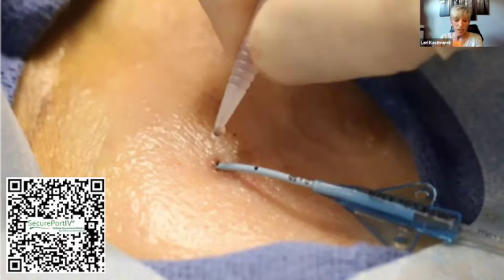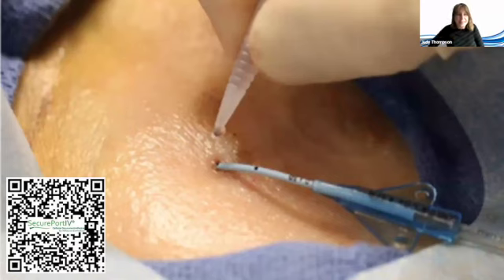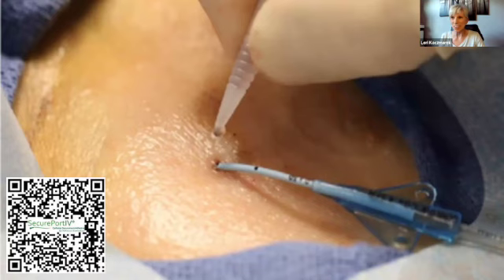If you're putting too much on, and I'll be honest, when I started working with this as a nurse, we're tempted to use everything like a unit dose. So we were putting it all on, the entire vial, but quickly learned that was a learning curve. Less is better. I can't take credit. My colleague Kelly, I think, came up with dot not a lot, or drop not a lot, one of those. But really starting small with your drops and really targeting your delivery to your insertion site, keeping the amount minimal. And if you do put too much glue on, or it accidentally comes out too fast, you can spread some out for added dressing adherence. So you can move it away from that insertion site.